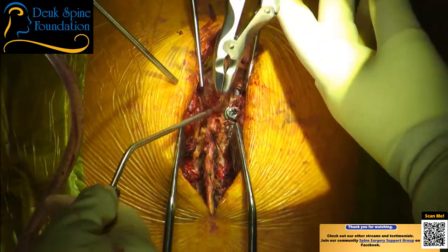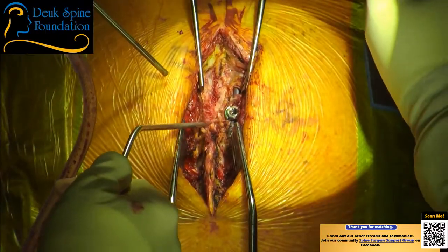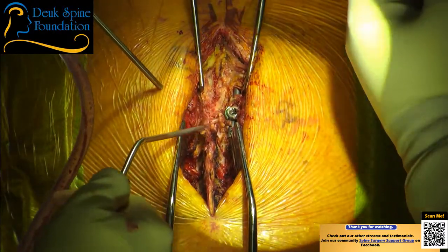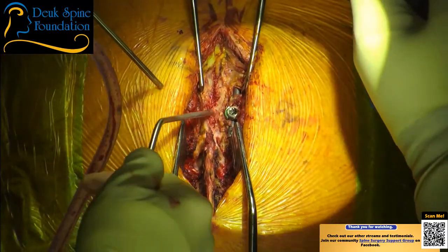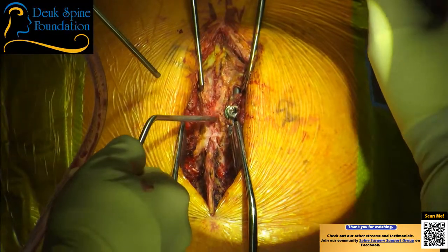How's our waveforms on the monitoring? So we're monitoring this patient's spinal cord. I have good monitorable waveforms, although the right amplitude on the lower SSEP is about half of what the left amplitude is. Yeah, this patient has their spinal cord squashed. That's what we're here to fix.